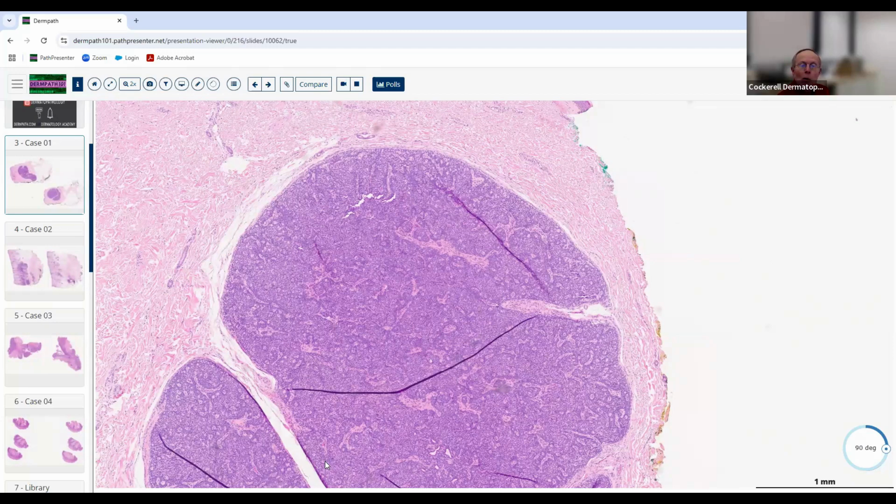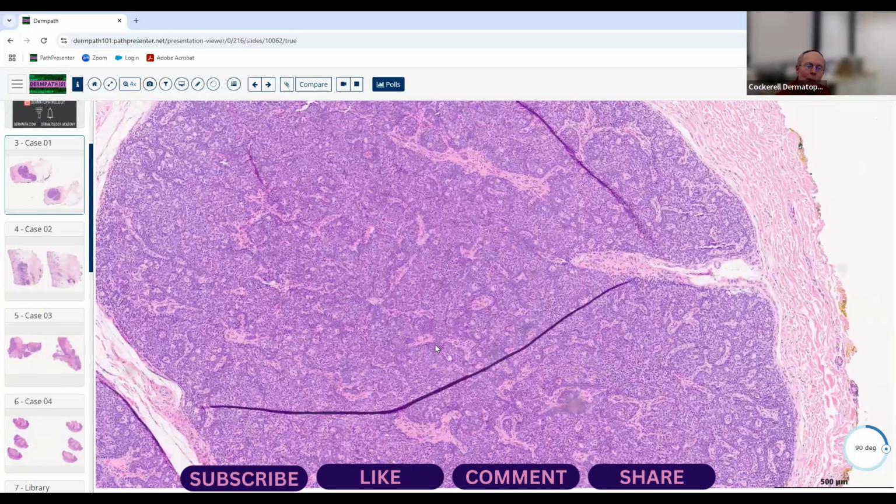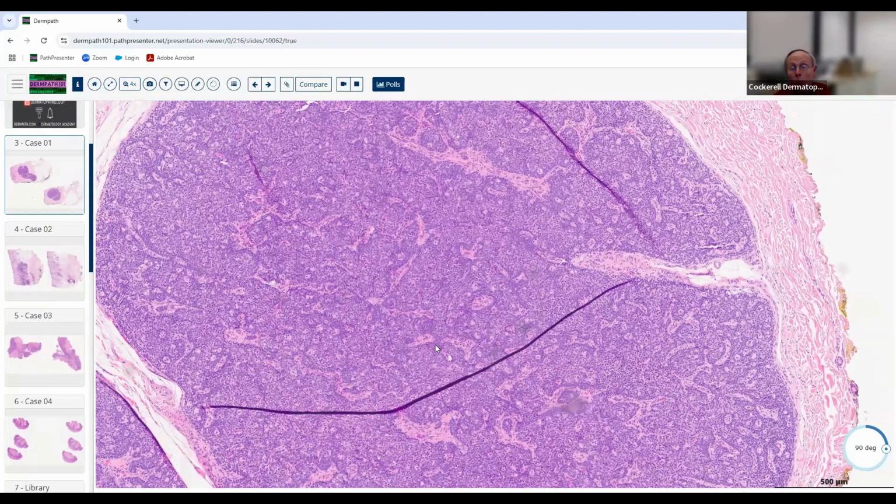You can get pseudolymphomas and lymphoid lesions of the skin, but sometimes you can actually get ectopic thymus, usually in the head and neck area, kind of like you get branchial cleft remnants up there. You can get Hassall's corpuscles and more squamous-type epithelium plus lymphocytes. So there's a spectrum of entities where you get epithelial components and lymphocytes being part of the actual tumor.